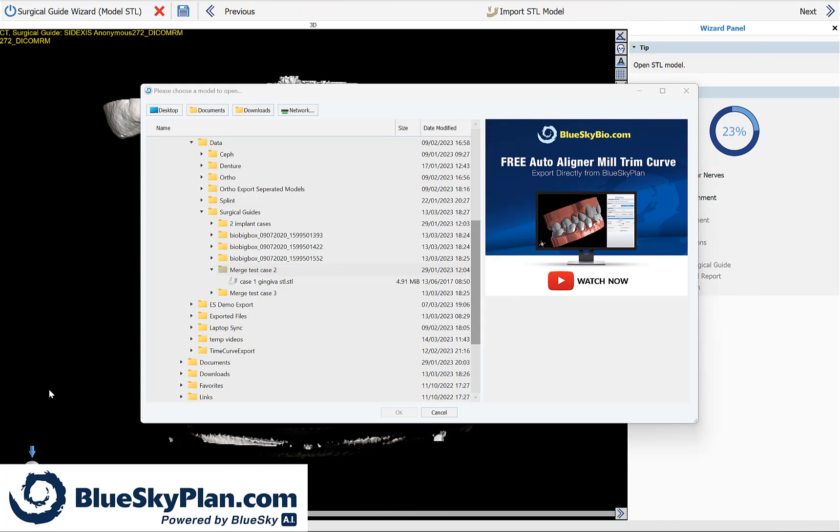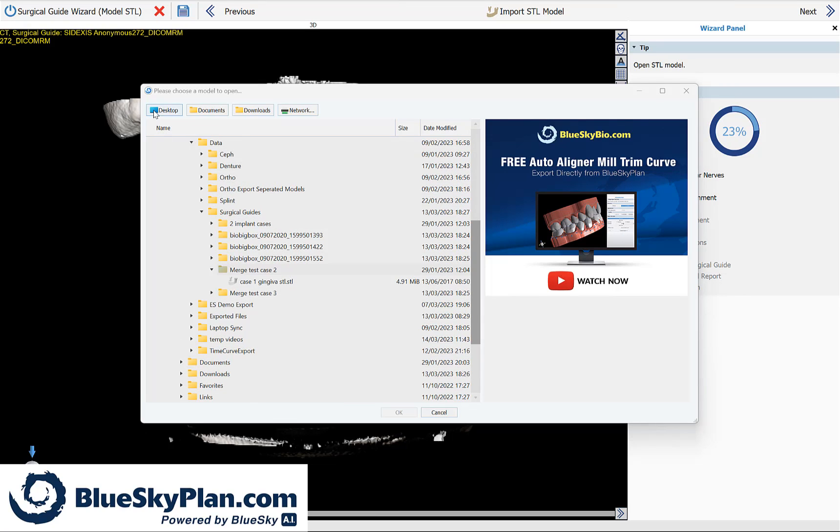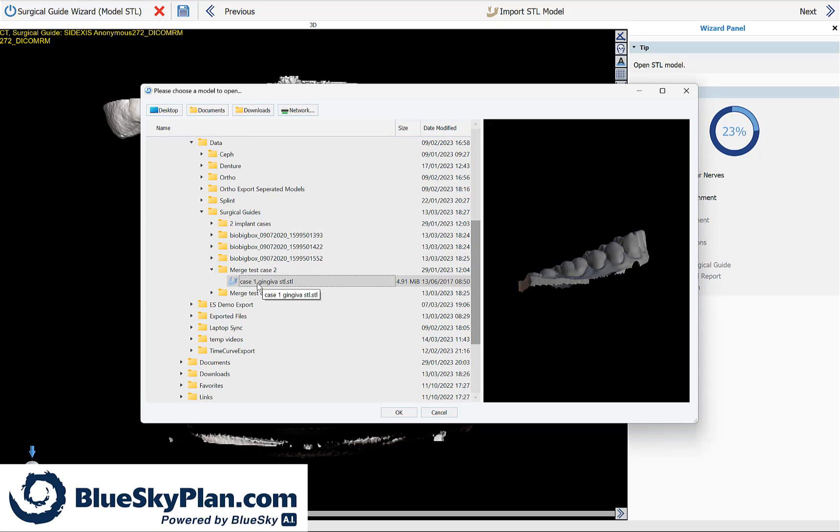The software now prompts you to select the model scan. Once again, you have your computer's directory with the shortcut buttons going across the top. Simply navigate to the relevant model scan. Select it by clicking with your left mouse button.